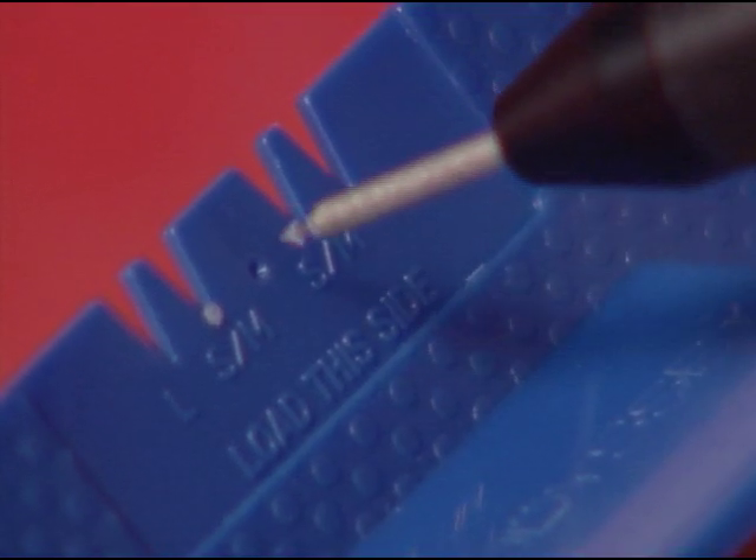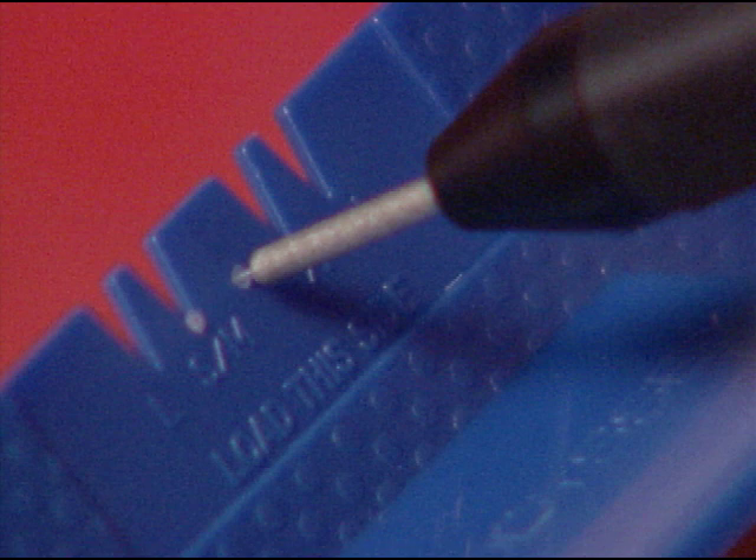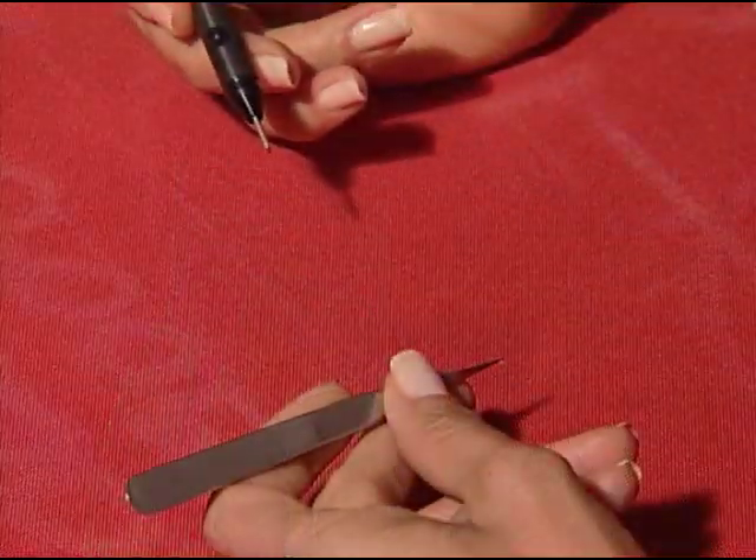If the plug is not completely loaded onto the wire, gently tap the plug into the cone-shaped dimple located in the center of the plug stand to ensure the plug is properly loaded.